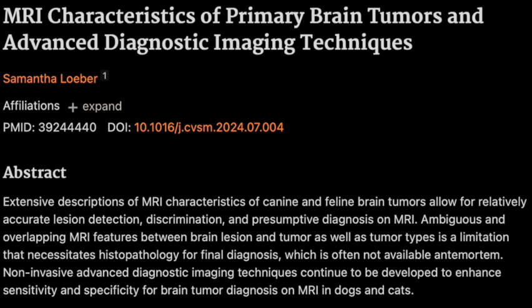So do meningiomas and gliomas glow up differently? Yes, they do. Meningiomas usually show this strong, even contrast enhancement, meaning they light up brightly and evenly after we inject the dye. Okay. Gliomas, again, less predictable. Of course. They might not enhance at all, or we see that ring pattern, or it could be patchy and uneven. So if MRI findings were like profiles on a dating app, meningiomas are the ones with the clear, well-lit photos, and gliomas are using those blurry, artsy filters.